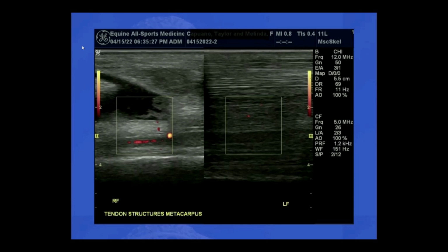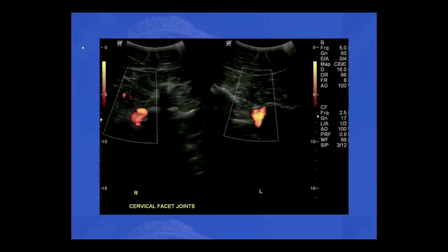and quite consolidated there. I mentioned I can use it for looking at facet joints. We've seen that quite often our X-ray is not really helpful in telling which of those joints is really the problem. Ultrasound might help, and I think that using power Doppler with ultrasound is a good tool too. We did a preliminary little study to compare the results of bone scan in that region, showing activity in facet joints, to power Doppler. That was quite a good correlation, but the problem is still that we're then not looking at arthritis or synovitis, or maybe the difference. So that's a project that is still under investigation, and I hope to publish on that maybe next year.